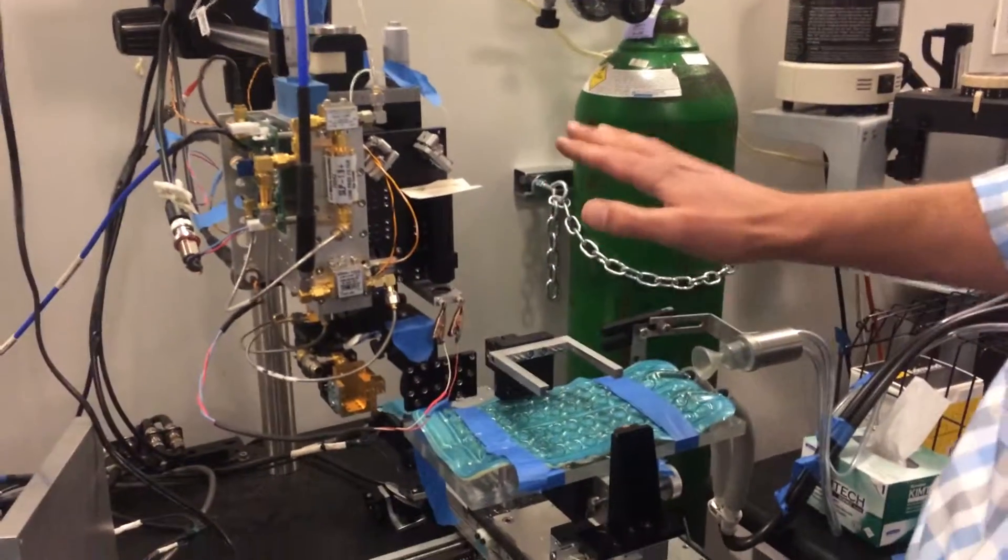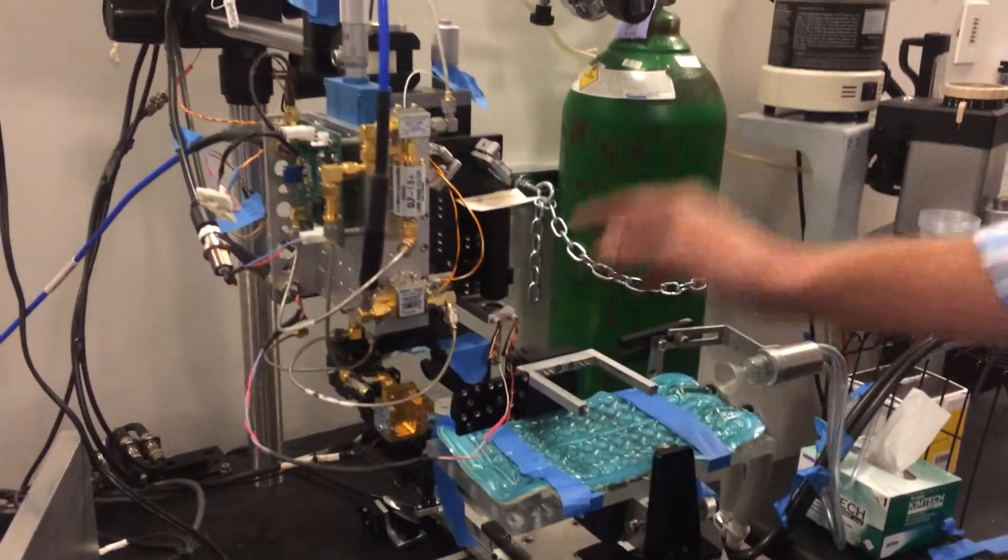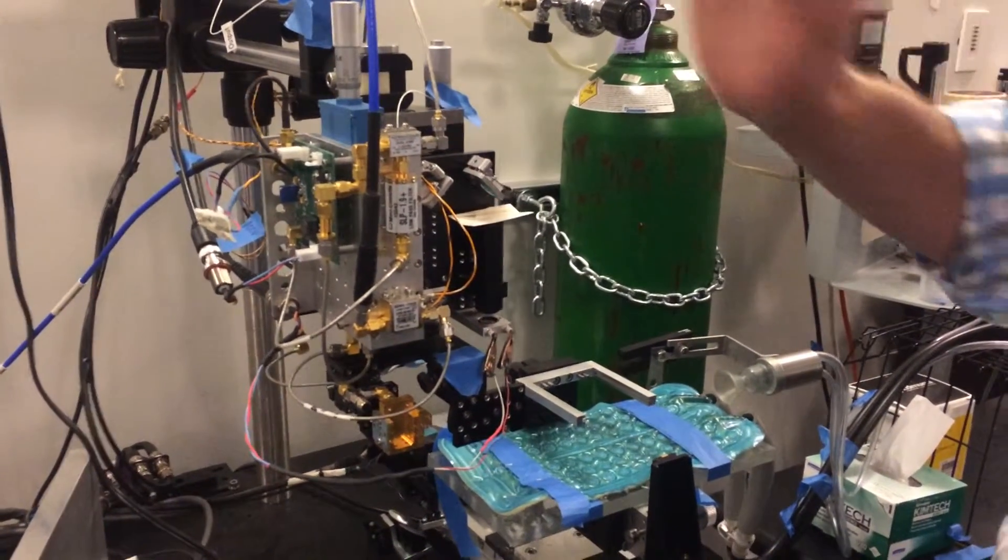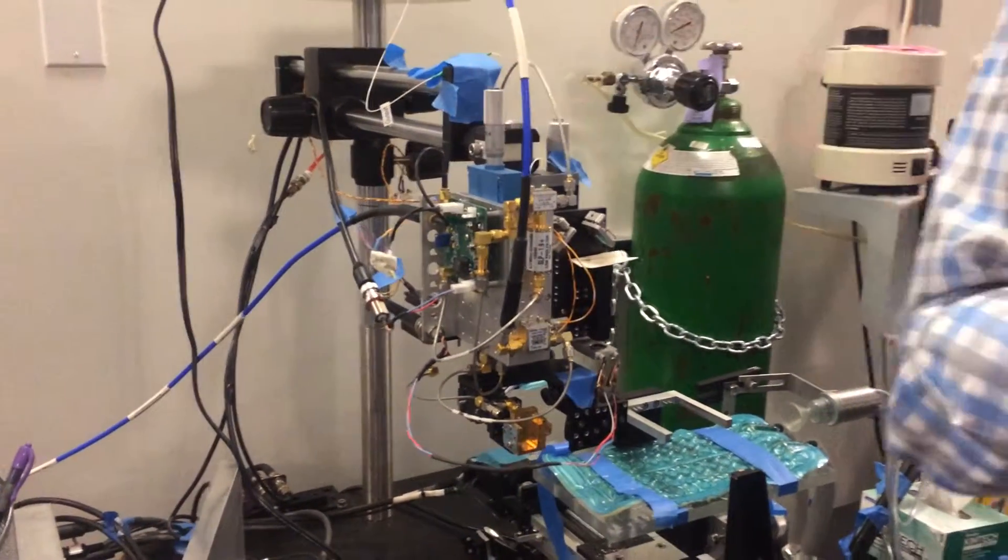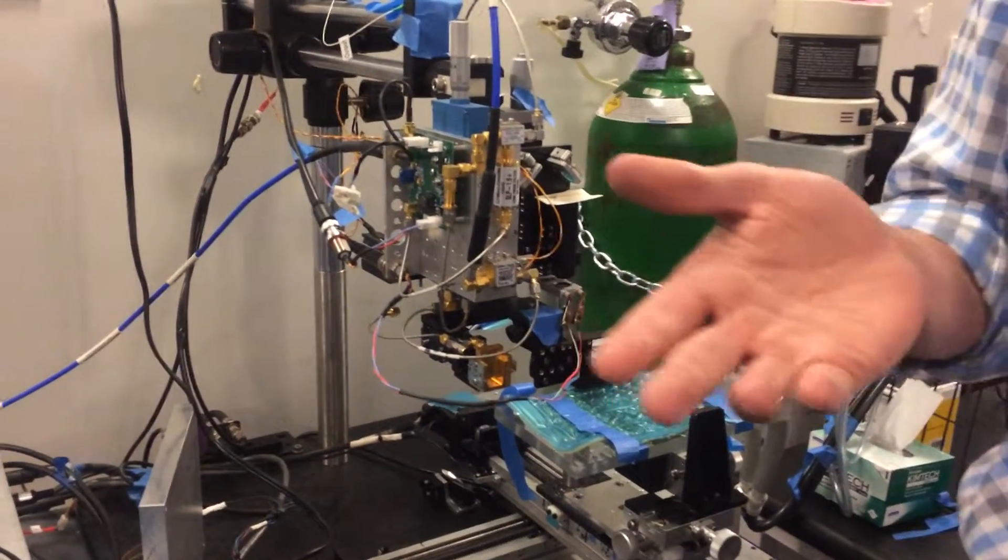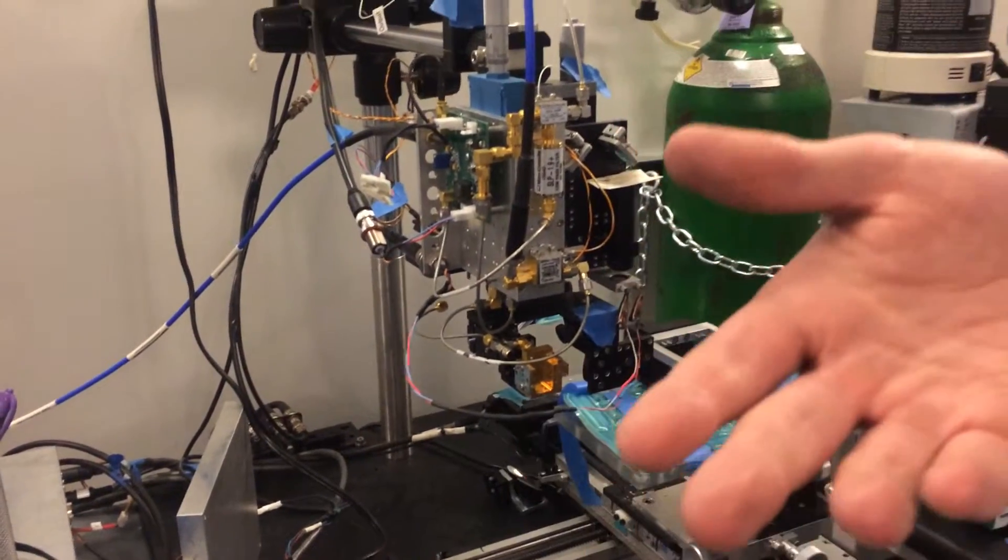Right now we're working on things that keep the animal fixed, keep the source detector fixed, and just scan the beam. That's where a lot of our engineering is focused at the moment because eventually the whole goal of any of these projects is to move to people. And you can't put the person on a translation stage. You have to leave them fixed and move stuff around.